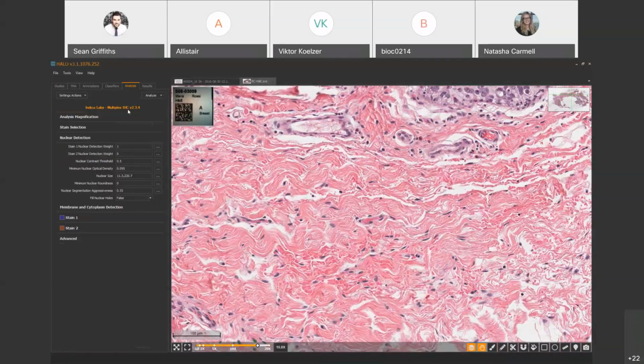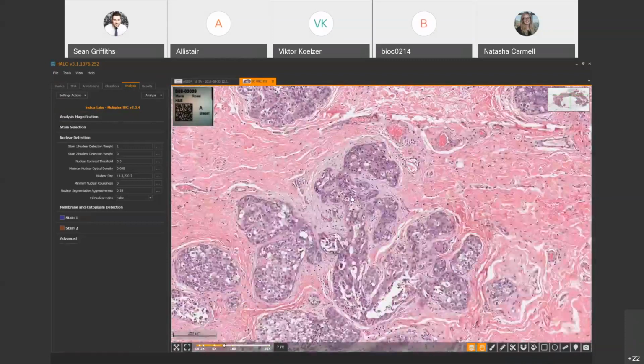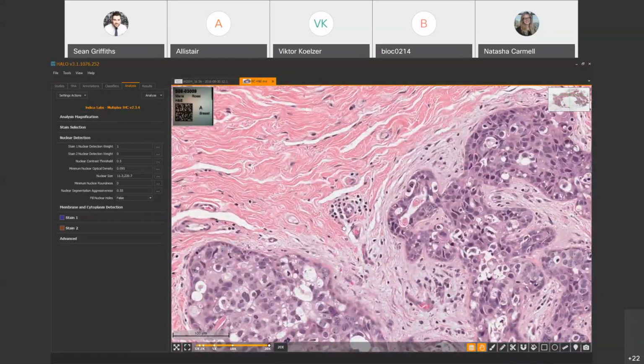One thing I would caution against is creating classifier to annotation type measurements when you're using the nuclear segmenter, because you'll generate a huge data set, which will probably just lock up your hardware depending on how powerful it is. So the viewer won't be able to manipulate 200,000 objects or polygons very easily, and you'll just end up with a very slow process. I imagine it would take hours rather than minutes.